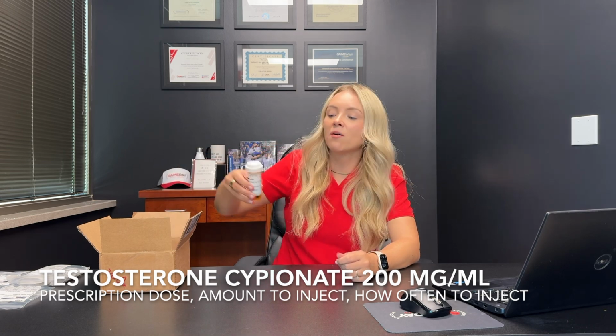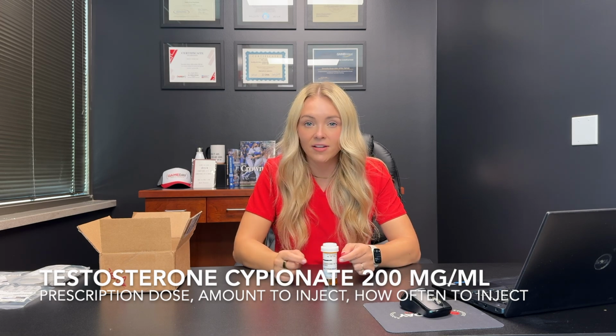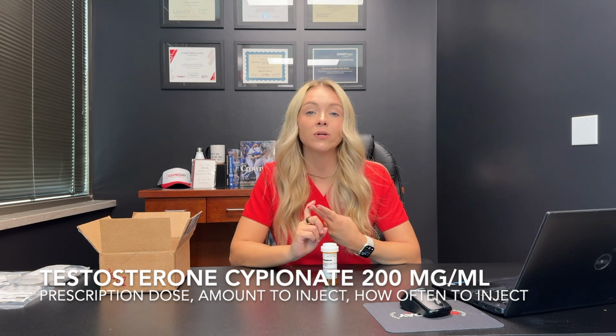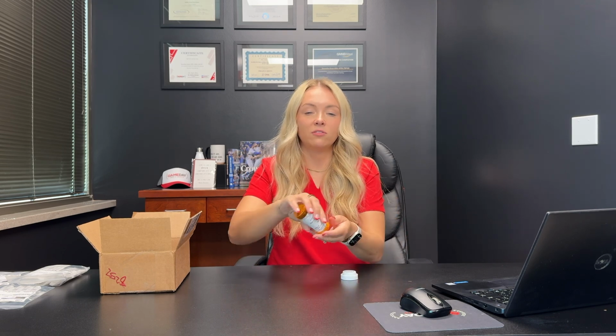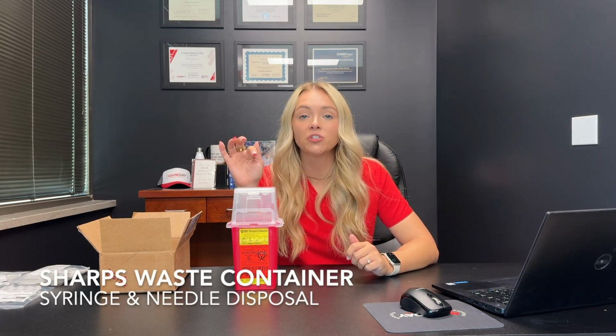Your testosterone comes in a pill bottle, kind of like this one. On the pill bottle container, there is a label, and on that label, it tells you your prescribed dose, exactly how much to inject and how often to inject it. This patient's dose is 80 milligrams, meaning that they're going to inject 0.4 mils and they're going to inject it twice a week. Inside of the pill bottle is your testosterone vial. Lastly, in your box, you'll find your sharps container. This is where you're going to dispose of your syringes and your needles after you inject.